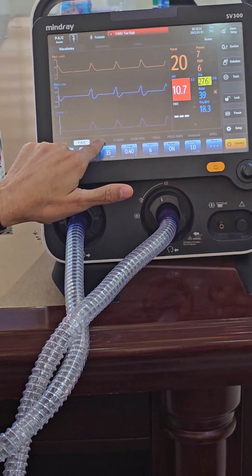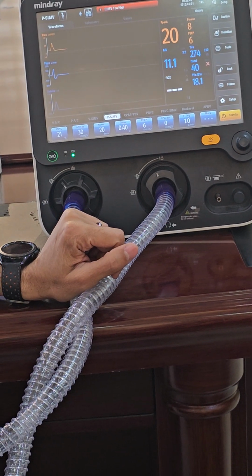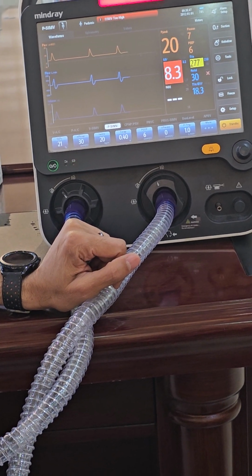Now let's go to another mode: pressure SIMV. What is the difference here with SIMV? Look at me.